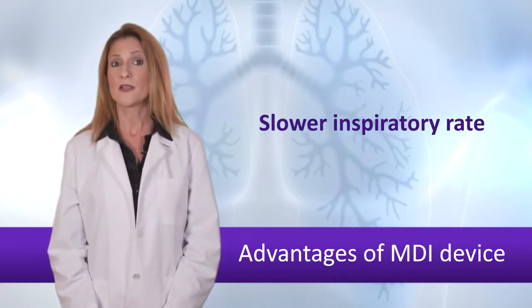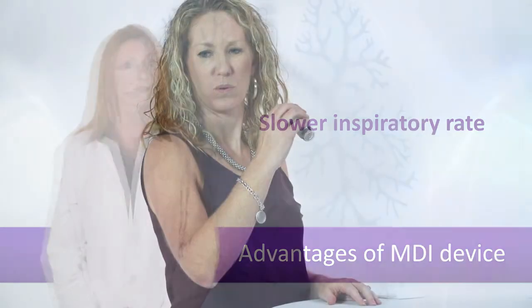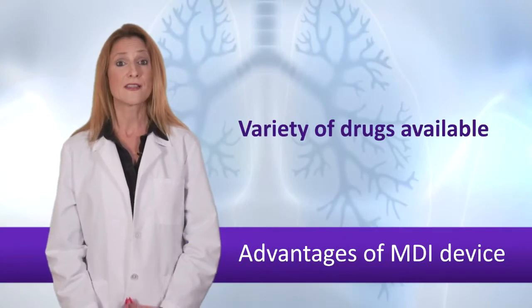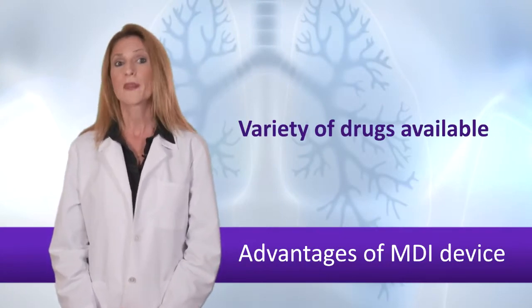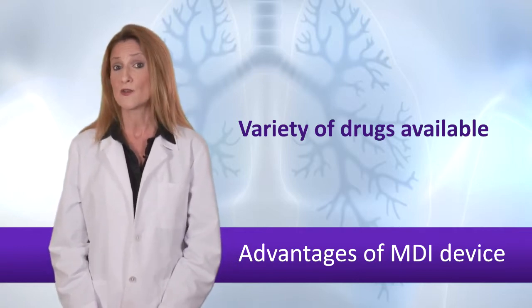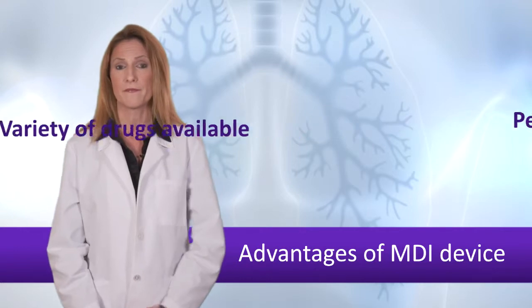MDIs require a slower inspiratory rate than dry powdered inhalers, so the correct inspiratory rate may be easier for young children, the frail, elderly, or those with severe lung disease. Quick relief, various controller drugs, and several drug combinations are available. Therefore, a patient taking multiple respiratory drugs could potentially use only an MDI to deliver all of them.